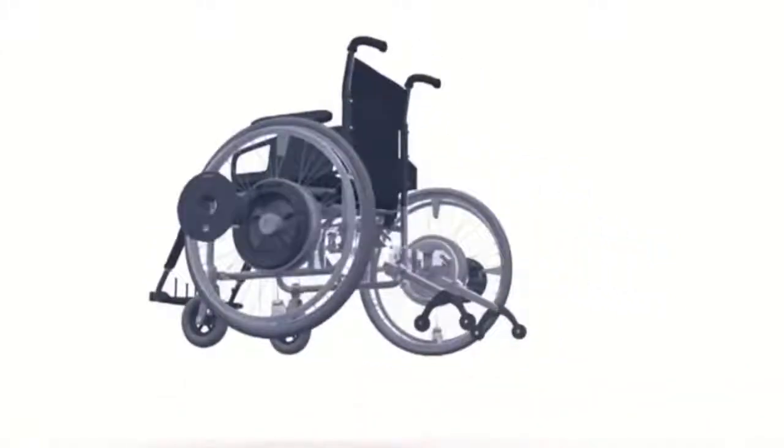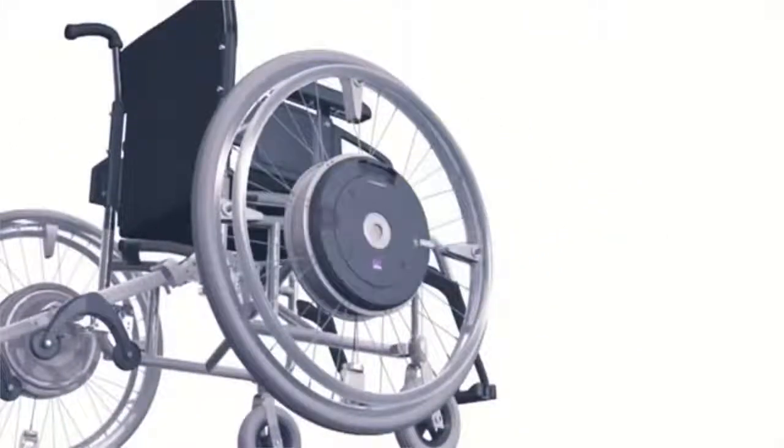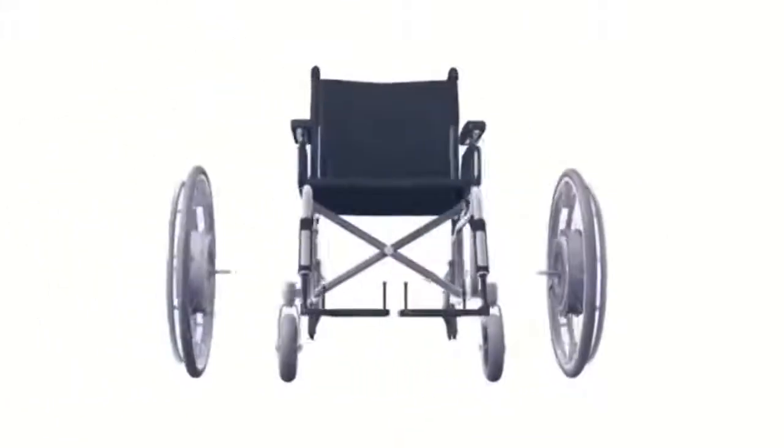E-Motion. Electric motors integrated in the wheel hubs give your wheelchair an extra portion of power for climbing slopes and overcoming long distances with no trouble at all.